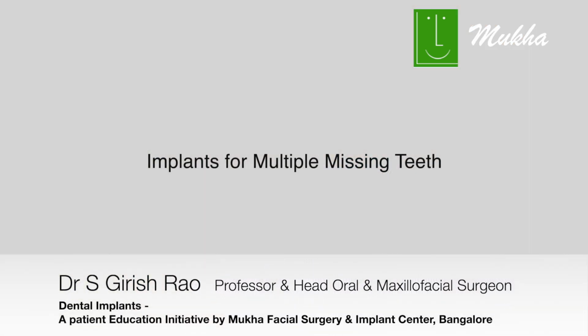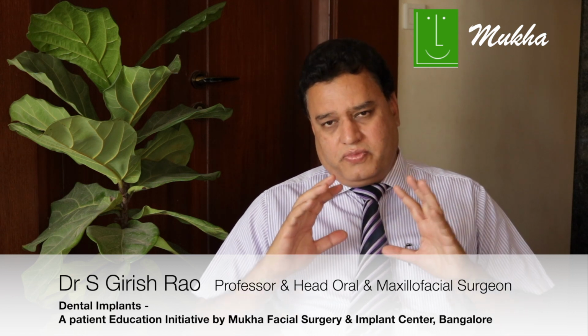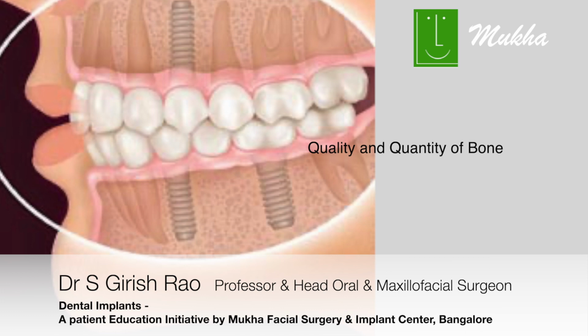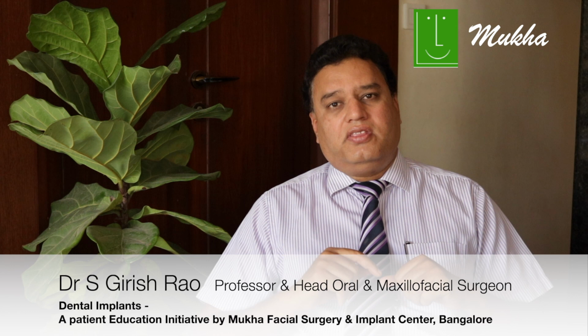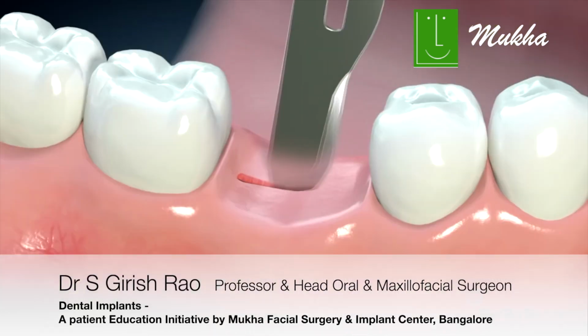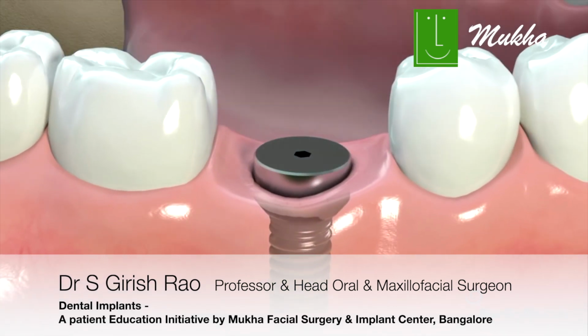How dental implants play a role in replacing multiple missing teeth. When multiple teeth are missing, a good assessment has to be done to see if the quantity and quality of bone which is available there is good. If the bone is sufficient, then we can do a very simple surgical procedure wherein we make a small hole in the gum and a hole in the bone and drop these implants in.